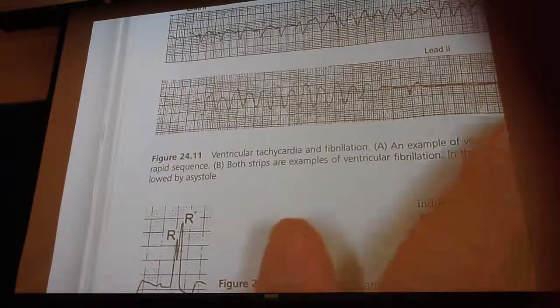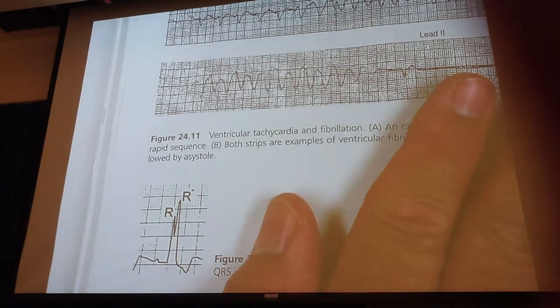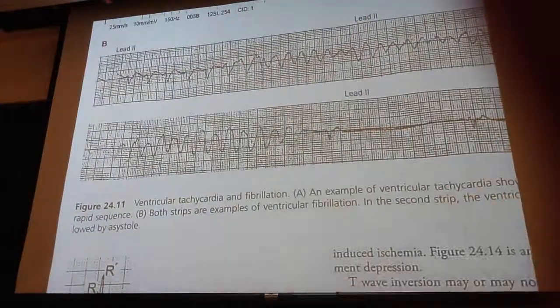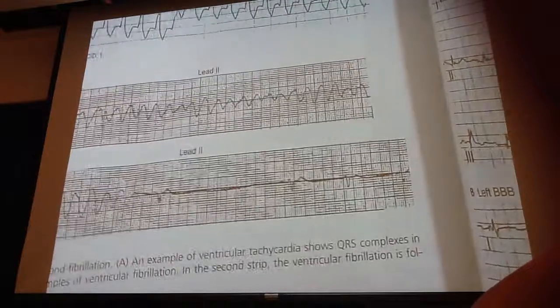Okay, what do we have here down at the bottom? Bundle branch block. The ventricle. Okay, bundle branch block, is it a left or a right bundle branch block? Okay, remember, let's kind of go back here for a minute, okay? Oh, let's see, where's the heart anatomy?